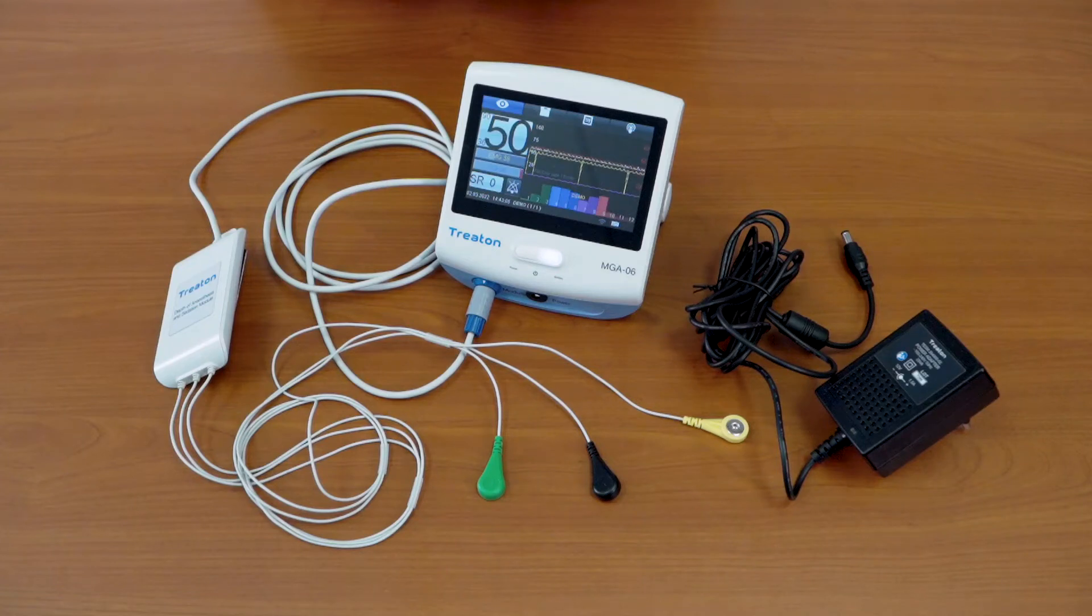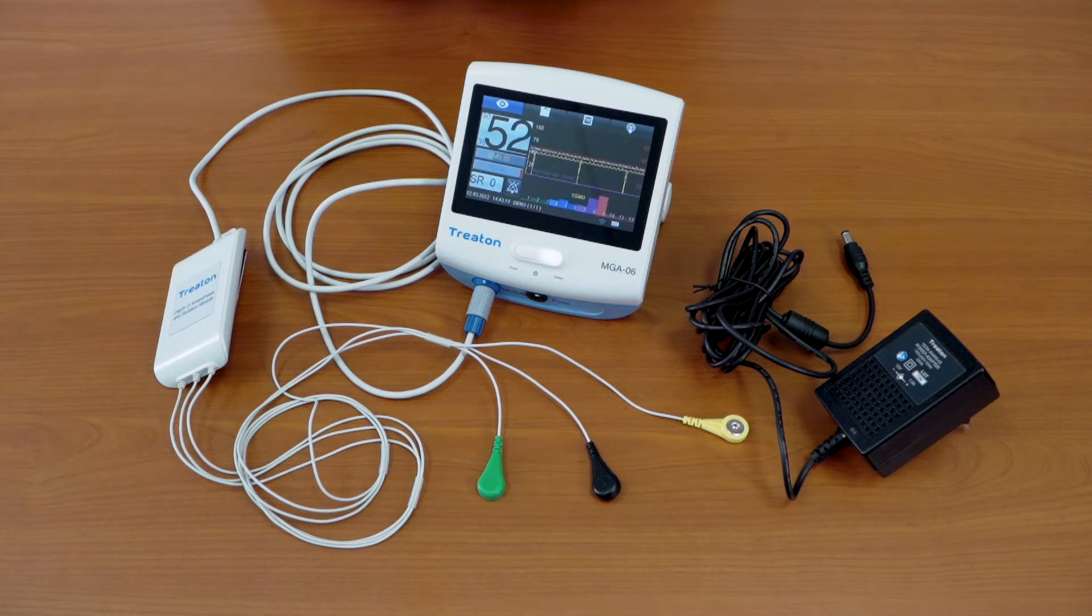The device is intended for evaluation of the brain activity. There are several world analogies: bispectral index monitors and entropy monitors. MGA06 estimates the electroencephalogram and processes EEG signal to calculate the level of the cerebral cortex depression.